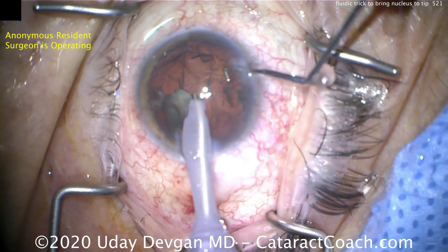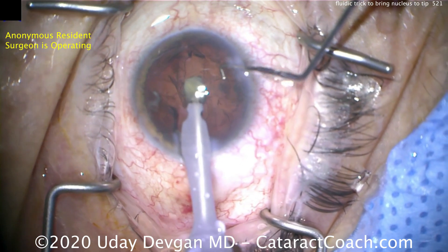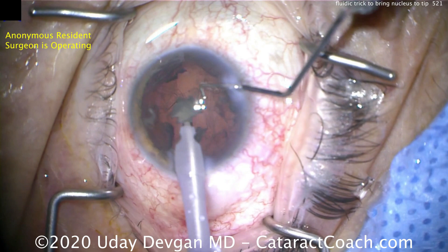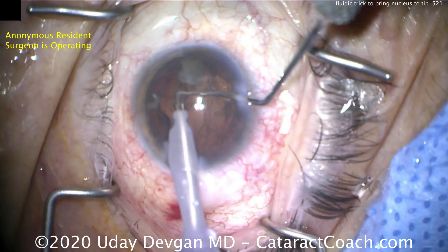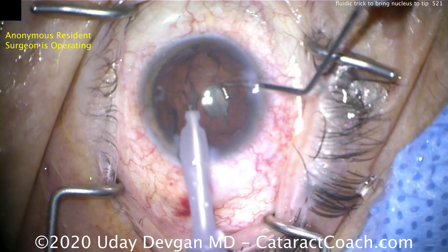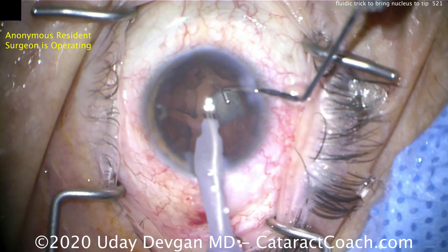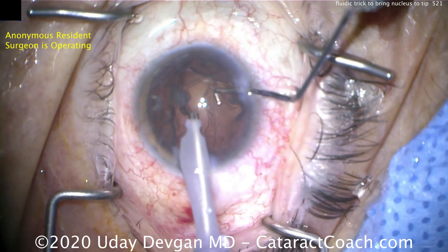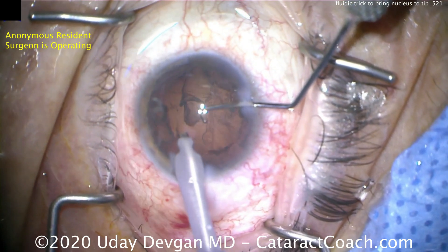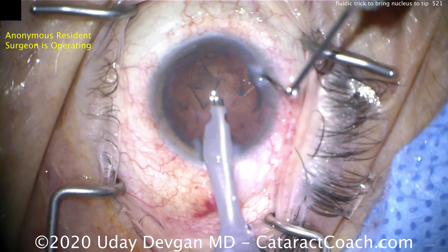Let me push that piece off and show you again. Apply vacuum and now twist the probe between your fingertips back and forth — that'll change the fluidic current in the eye. Let me show you again: push the piece off, it dances around a lot. Apply vacuum and now twist the probe back and forth. It'll change the fluidic inflow currents.